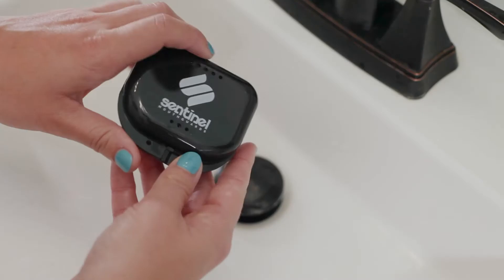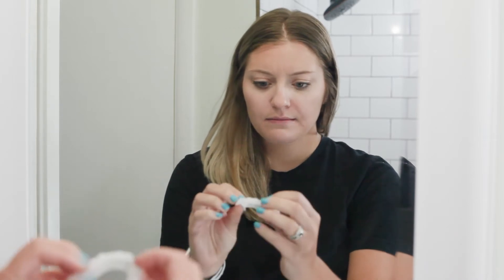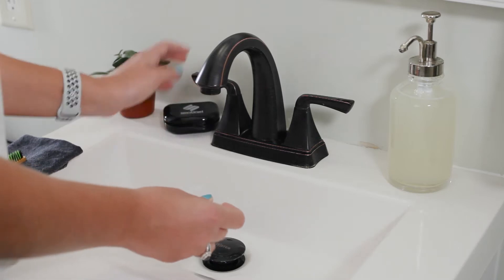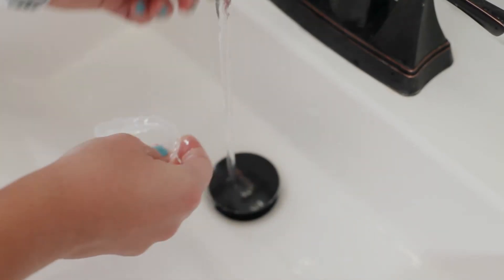Anyone who's had experience wearing a mouth guard knows that they can turn pretty funky if not properly cared for. A regular cleaning routine can not only keep your mouth guard fresh and clear, but it can also prolong its lifespan.